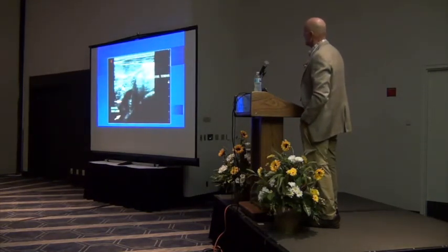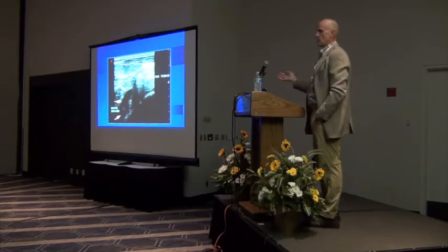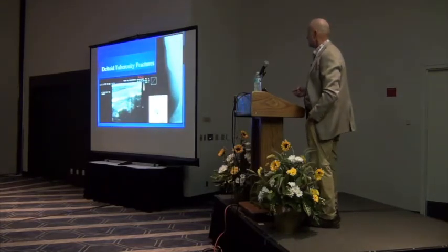So large fluid pocket sticking out there. And again, we drove an ultrasound guided needle into the fluid pocket, and you can block these as well to confirm that in fact is the source of pain.